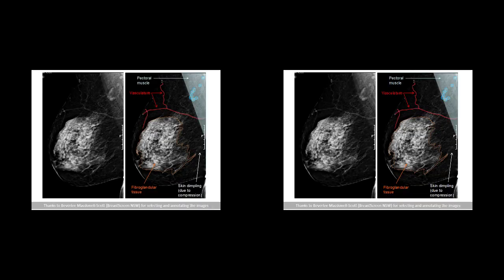So we'll have a look at that now. Every breast will appear completely different on a mammogram, and actually what has a huge impact is the processing applied to the images by the vendor. I don't think I have it in my talk, but one of my colleagues has been screened with mammograms for several years and has had mammograms taken on 3 different machines, and even for the same breast in a short space of time, the image is quite different. So what can make or break a company breaking into the mammography market is how they process their images, because the radiologists have a very particular view about how they like the images to present, whether they like them very black and white or that greyish film style appearance.